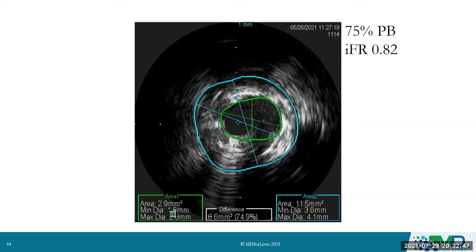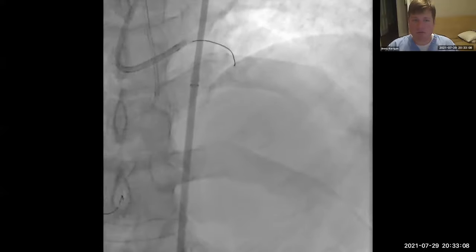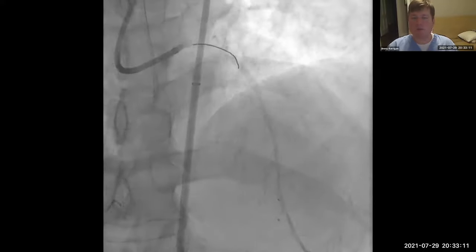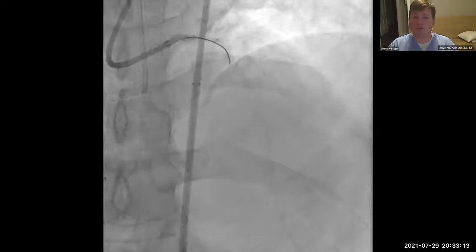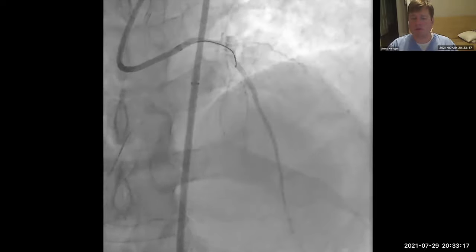So this patient now has an occluded circumflex, an occluded diagonal, a physiologically significant proximal LAD, a physiologically non-significant 70% stenosis in the posterolateral, a young, active, healthy guy, so we stopped. And we asked our surgeons to evaluate. I can say that they were skeptical, because on the angiogram, we presented this at our heart team meeting, and everybody was laughing, where's the stenosis? Until I showed them the IVUS and showed them that there is a relatively discrete 70% stenosis. I don't know why it kept leaking contrast, a weird cyst tissue.